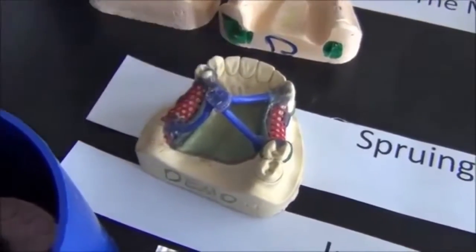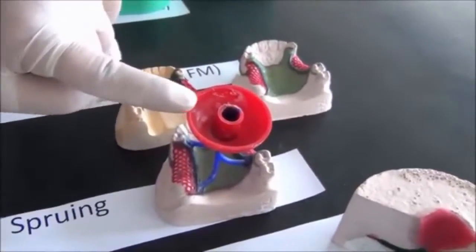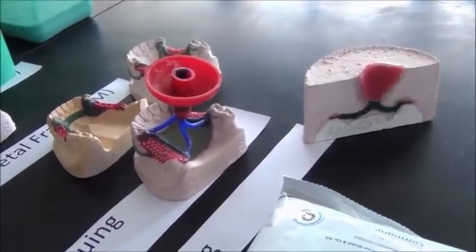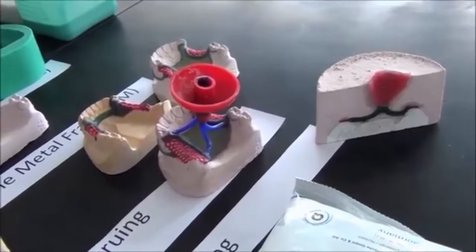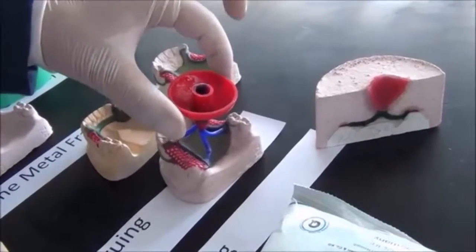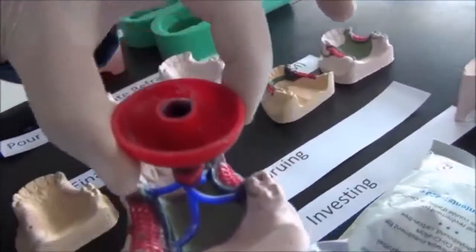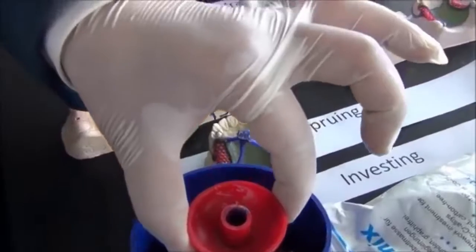These sprues later on will be attached to a funnel. These are extra components essential for the casting process. This finished wax up with the spruing on and the funnel is placed in what we call an investment ring.